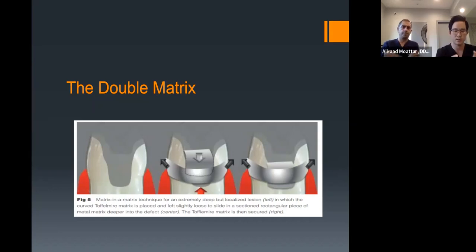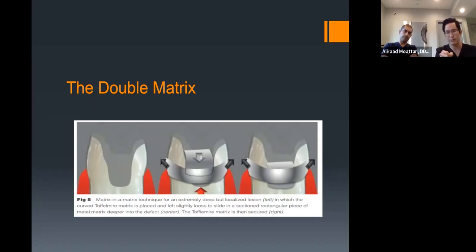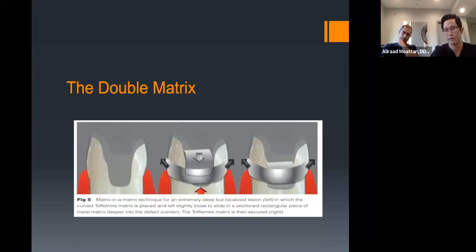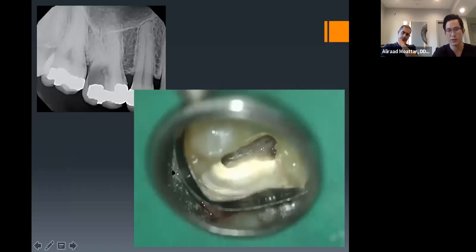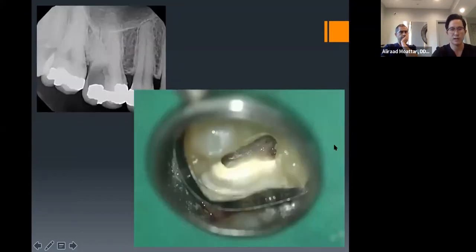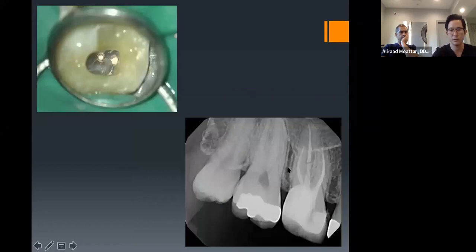The double matrix technique: a combination of the Toffelmyer and sectional matrix. Often you can secure a Toffelmyer and add a sectional matrix inside to reach the deep portion. Place the sectional part first, then the Toffelmyer around it to close gaps. Teflon tape can pack and wedge any remaining gaps. Example case: caries almost to the bone. A sectional band inside the Toffelmyer, MB2 found, finished product shown on the bottom right.